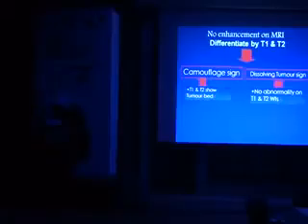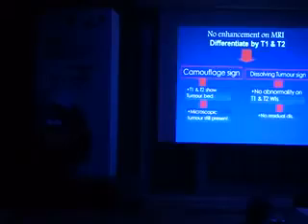There is the tumor bed, while a dissolving tumor sign means no abnormality on T1 and T2. So, in camouflage, there is a tumor that shows only on T1 and T2, while the vanishing tumor does not show any abnormality on T1 and T2. So if we have abnormality on T1 and T2 with no enhancement, in both conditions we don't have any enhancement. But if we have abnormality on T1 and T2, we still have viable tumor there, hidden, resting.